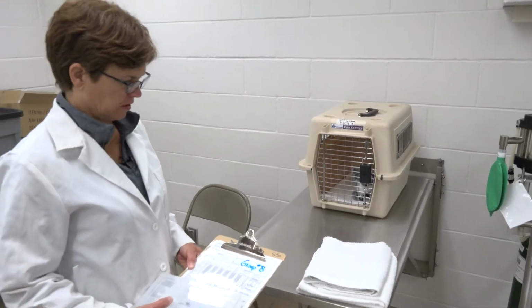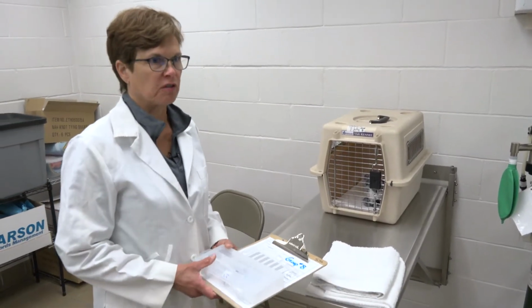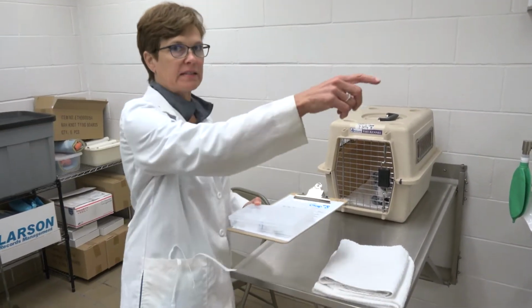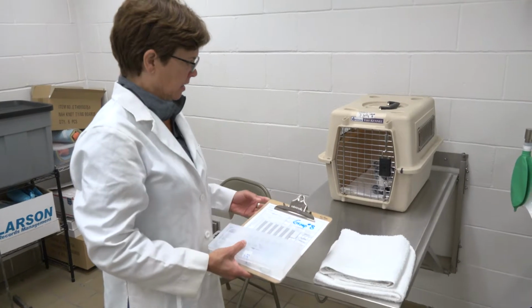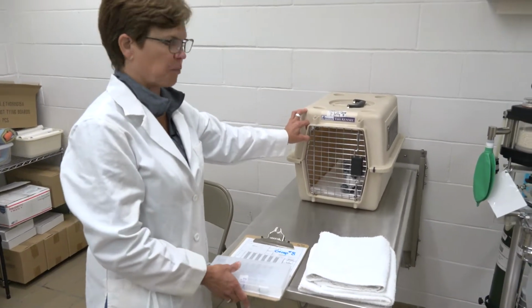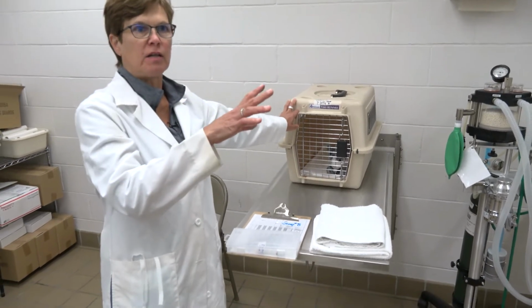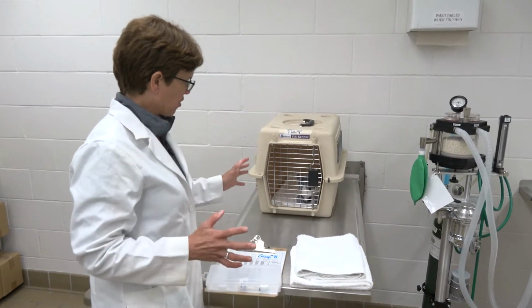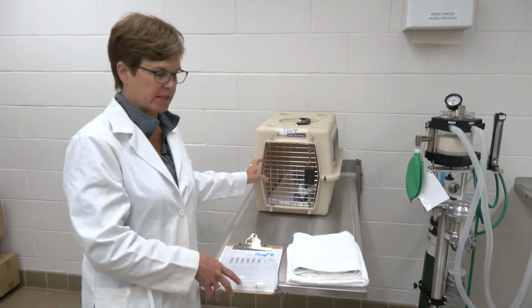So for the real live animal surgery, you'll find your patient in kennels, which are located on this side or on that side. And you will have your cat's name, obviously, and you're going to pre-med in the kennel and then put the animal in their carrier. They have their own carrier that they come with. For the dry run, we're just going to do it right here in induction.